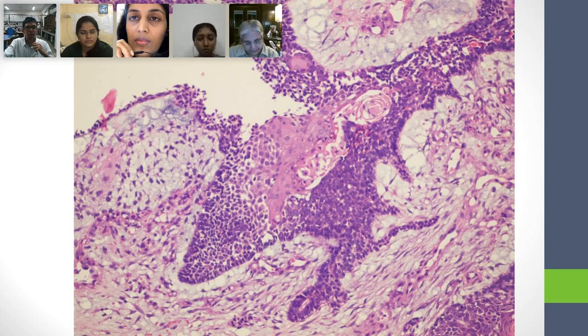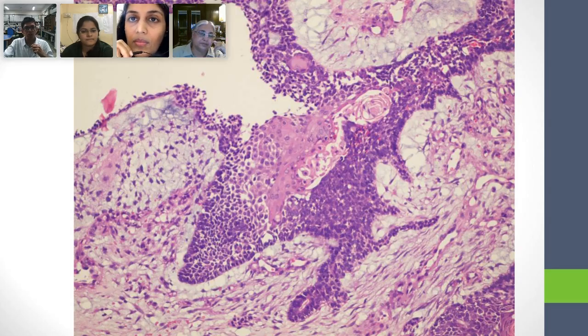First of all, ma'am, I don't consider this as a dysplastic epithelium because this is a tumor. This is all the lesional cells that are there. And to compare for dysplasia, there should be some normal tissue as well to be sure. So if there is no normal tissue, you cannot make a diagnosis of dysplasia.